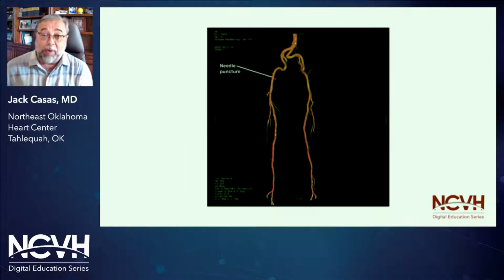Another issue that we deal with are these markedly tortuous vessels. This doesn't look like there's any issue with regard to calcium, but certainly with the tortuosity, we're going to spend an inordinate amount of time trying to get across. Thus, you need to be able to switch over your procedure to an antegrade access if you want to be a full service lab.